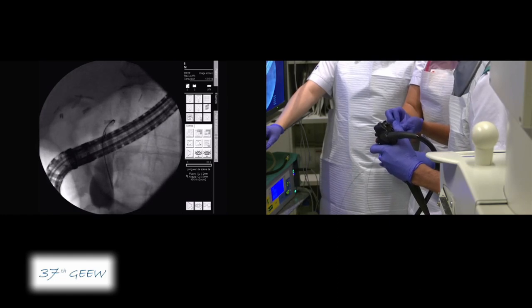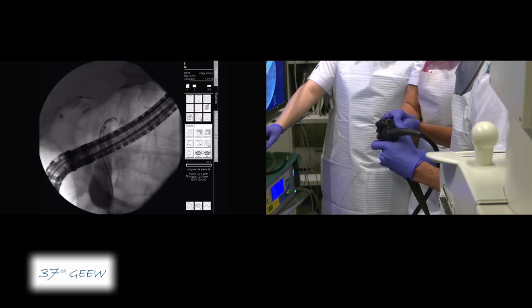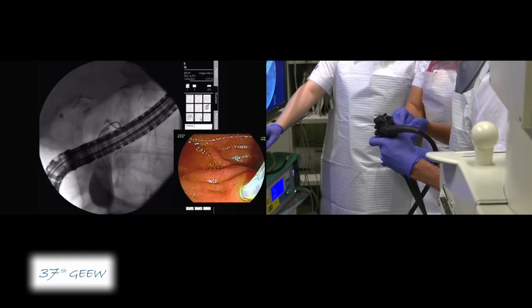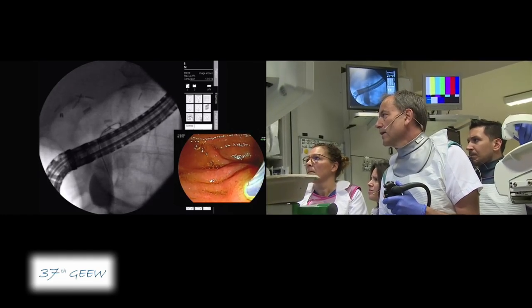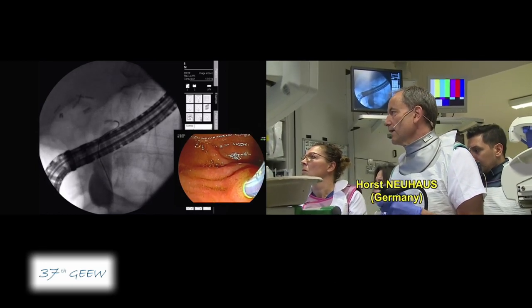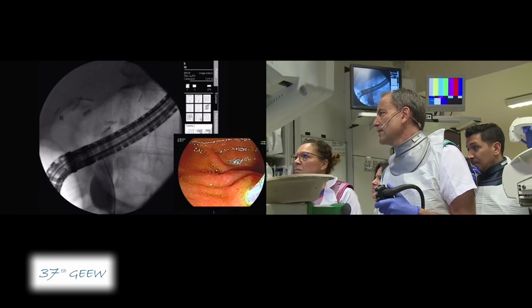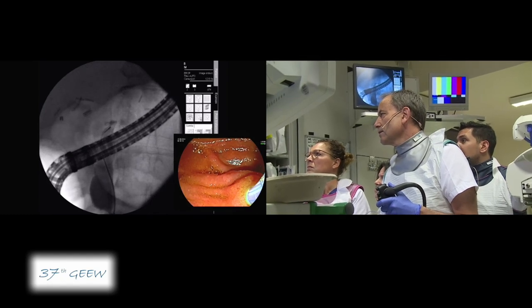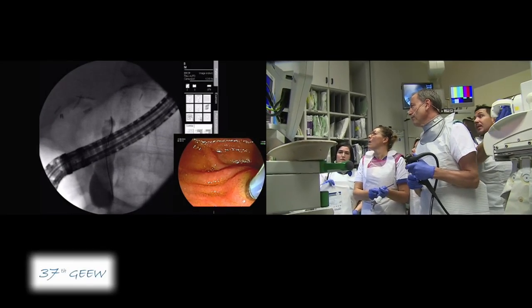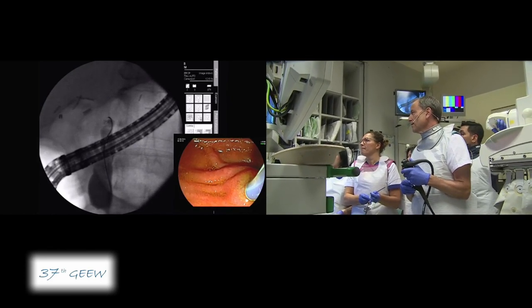The guidewire is making a loop just below the stricture. I change the sphincterotome — we can bend it a little bit to change the position. The wire makes a loop again so I go back. Would it help to have a balloon at this stage? Maybe, but first we try a little bit more. We inject contrast — there is a small passage of contrast and there is a metal clip. There is no flow of contrast at all at this stage. If we fail with this technique, we could do a sphincterotomy and then use a balloon to straighten the duct.